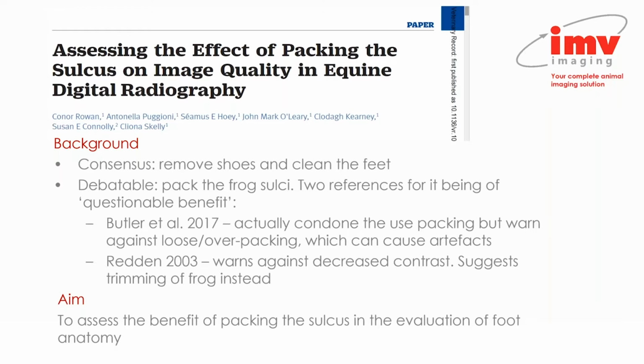They did provide one other reference, and this author did warn against the fact that with packing, we can lead to decreased radiographic contrast, and that author suggests that trimming of the frog instead is preferable.